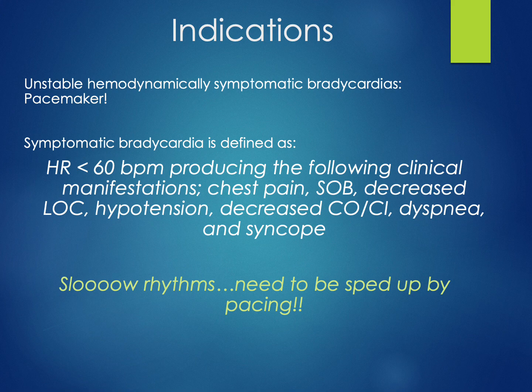And that is sending electrical shocks to our patient's heart at a set heart rate that we want them to have. So for example, our patient who had that heart rate of 45 and was dizzy and confused, we could pace that patient to, let's say, 90 beats per minute. Therefore, we're sending 90 little electrical shocks to his heart each minute. We're basically pretending to be that SA node, that pacemaker, and we're taking over that pacemaking responsibility.